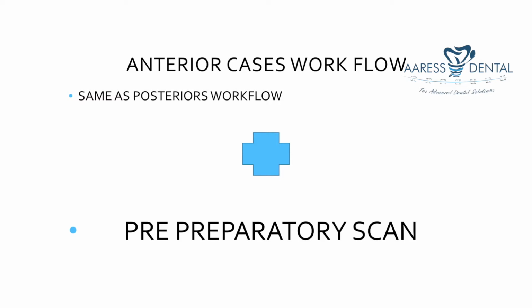Now we'll see the workflow for anterior cases. It is the same as the posterior workflow, but what we need is a pre-preparatory scan. It is nothing but a study model. What we take, no impressions we take just before the treatment, we call it as a study model, right? Same way we take a study scan or a pre-preparatory scan.